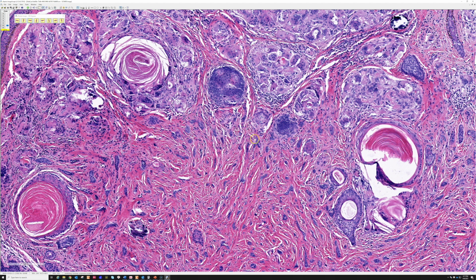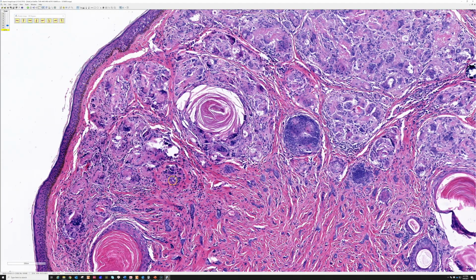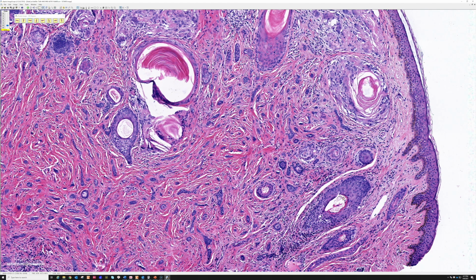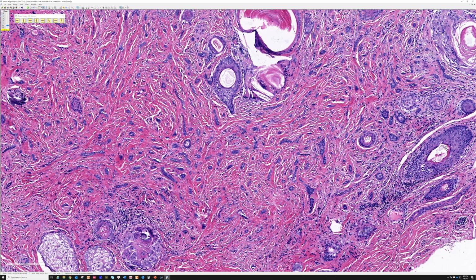I think syringoma is the easiest one to rule out because usually right away, even on a small shave, you'll see multiple ducts. The ducts are very easy and obvious to see, and you usually don't have keratin-filled cysts. Basal cell is usually pretty easy because even though morpheaform basal cell can have areas like this, usually you're going to find some areas that have peripheral palisading, clefting artifact, mucin around, or myxoid change in the stroma, or islands of obvious basal cell.